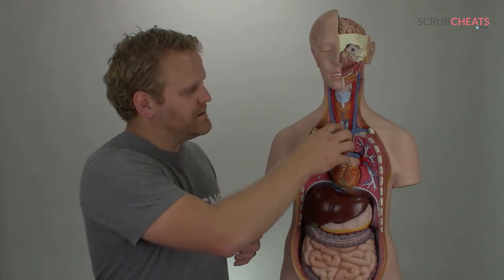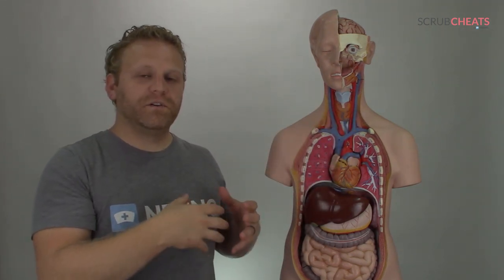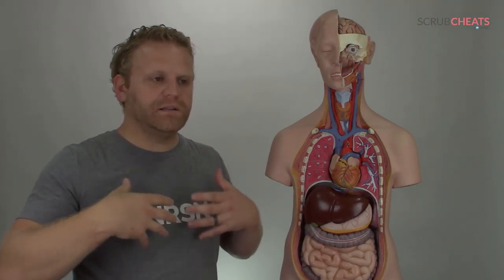Now trach masks are going to fit, let's say a patient has a tracheostomy, a trach mask is going to fit right over that and it's going to deliver humidified O2 to keep the trachea humidified.